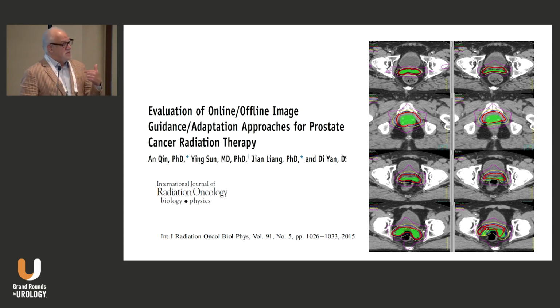And I maintain, because I do a lot of this and do a lot of SBRT and a lot of real-time cone beam checking before treatment, that if you follow a strict protocol in terms of bladder filling with a full bladder, and that means giving the patient at the time of simulation and at the time of treatment the exact same number of cups of water, and waiting the exact amount of time for that water to basically pass through, get digested, filter through the kidneys and into the bladder, you can pretty much get the same bladder filling. It's not perfect every time.